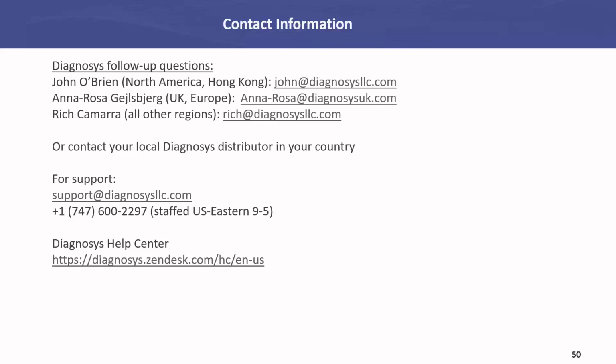One, let's start off with this. Your opinion, both of you, Anna-Rosa maybe first, and then Natalie. I think combined, you guys have probably close to 30 years of experience working with electrophysiology customers, and you're obviously really familiar with our software, and I think also with the software of other companies that are our peers in the market. Here's my question. How would you compare the capabilities we have for protocol creation and exporting to other companies' software, just at a high level? What do you think are some of the advantages we have?